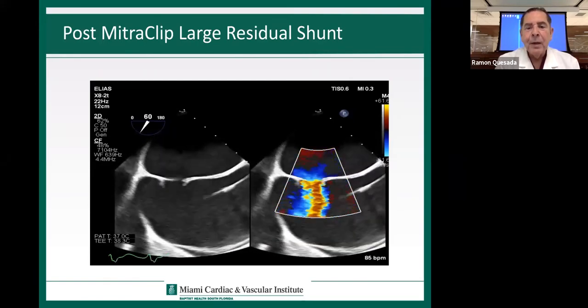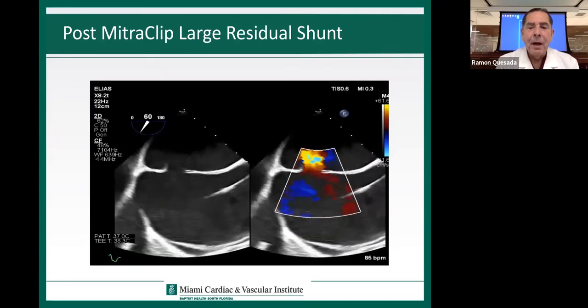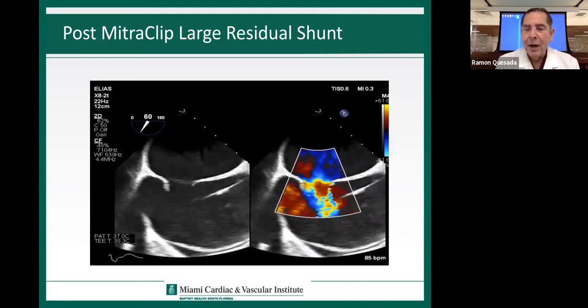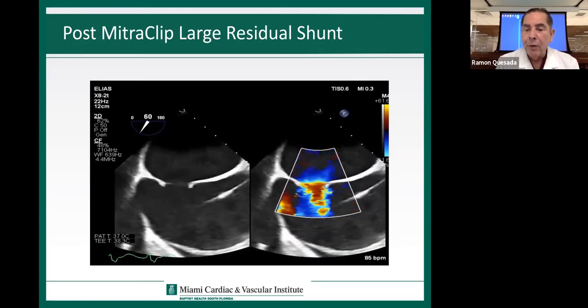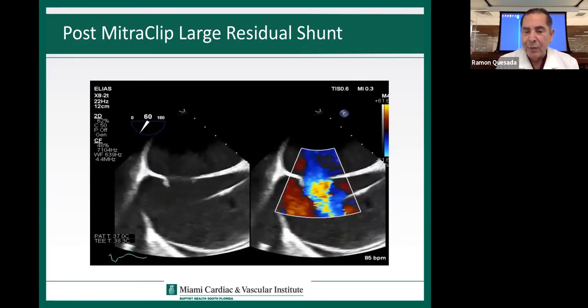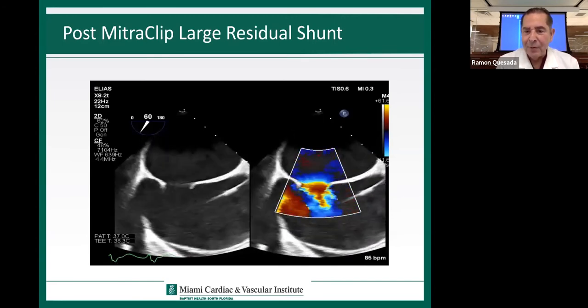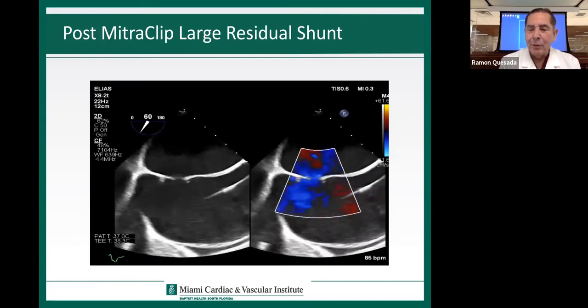And as a matter of fact, in patients who have severe cardiomyopathy, the fact that you're decompressing the left atrium, this transient bidirectional shunt also is helping you to decompress the left atrium at the beginning, so the patient doesn't have that increase in afterload, as it happens in surgery, in patients with low EF. But this is a little bit too much.